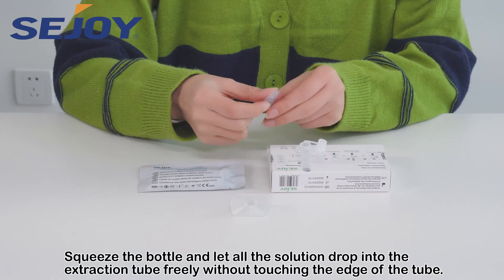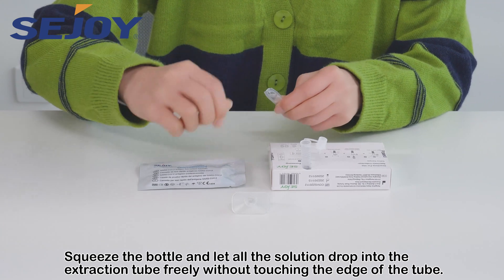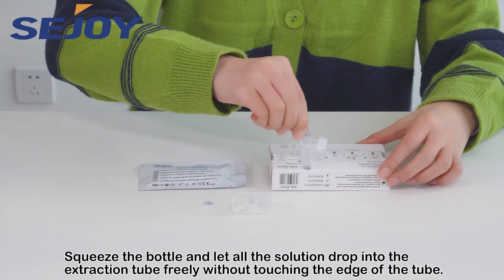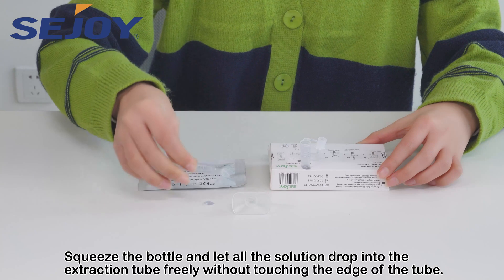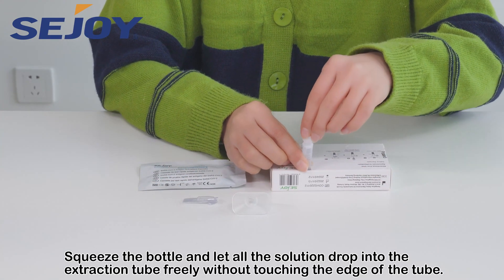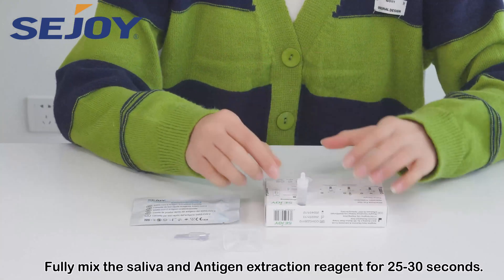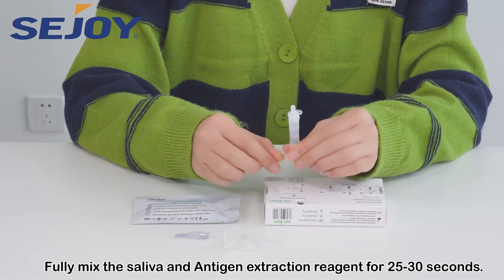Squeeze the bottle and let all the solution drop into the extraction tube freely without touching the edge of the tube. Fully mix the saliva and antigen extraction reagent for 25 to 30 seconds.